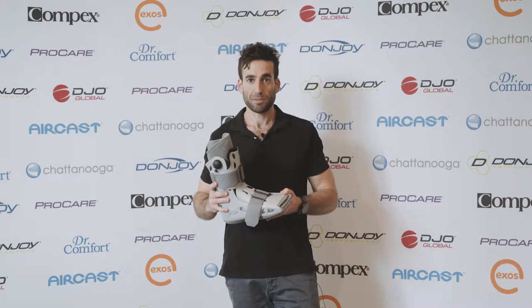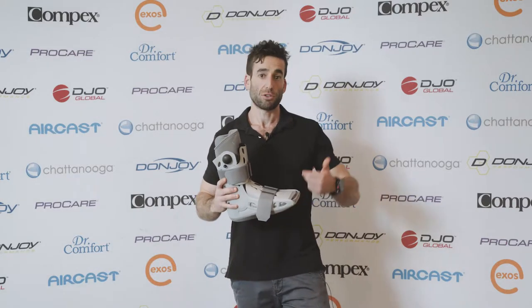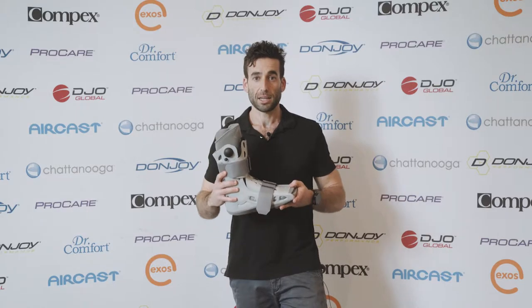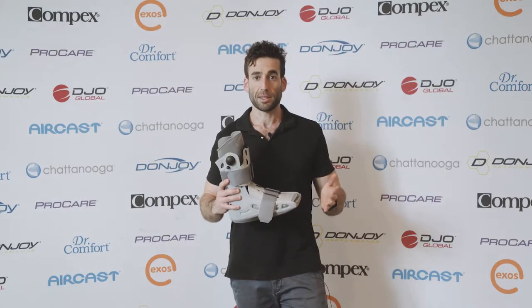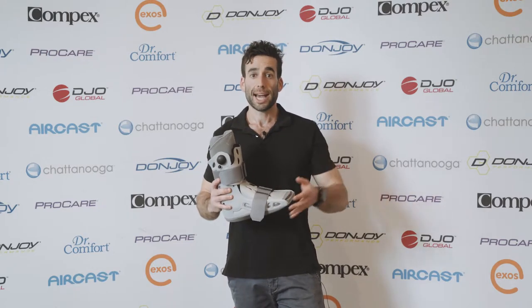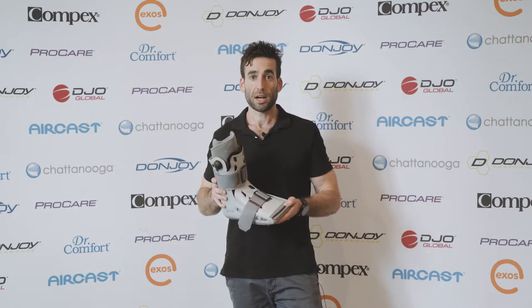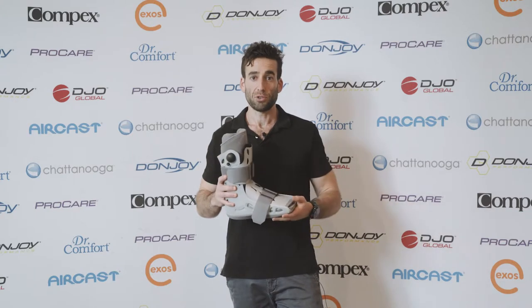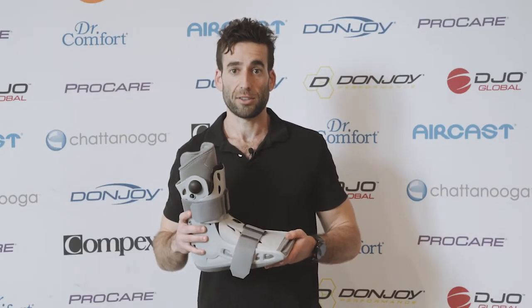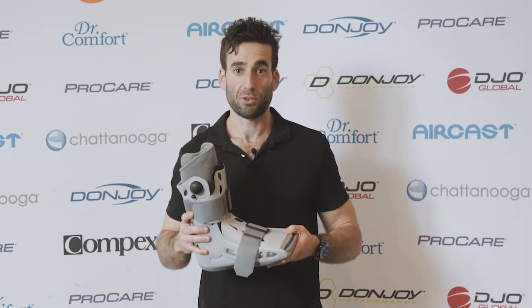There used to be a belief that when you have a fracture or a bad ankle sprain they would put you in a cast and non-weight bearing, but that theory is out the door now. I often find that even for a minor ankle sprain, putting on one of these air cast boots for even a few days up to a week has a lot of benefits in terms of a quicker recovery time for the patient.